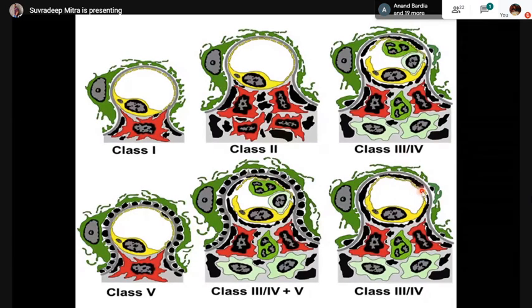In contrast, there is only massive subendothelial deposit. This is morphologically depicted as a wire loop lesion, but no endocap. Still, only a wire loop lesion will also be categorized under class 3, class 4, as a proliferative kind of lesion. So this is a peculiar scenario in lupus where there is a lot of subendothelial deposit but no endocap, but we consider this an equivalent for endocap and label it as class 3, class 4 and not as class 2.